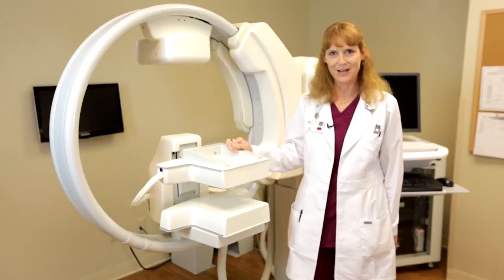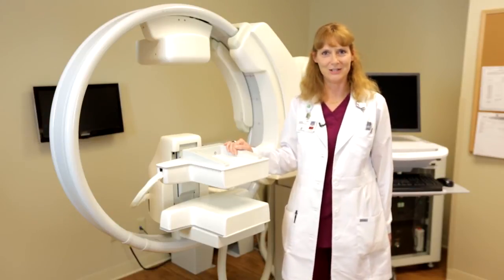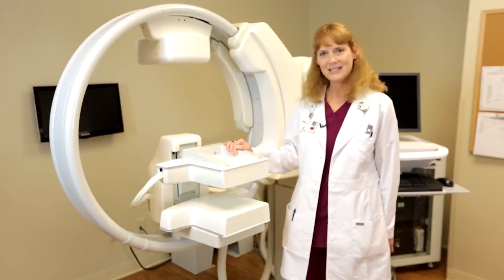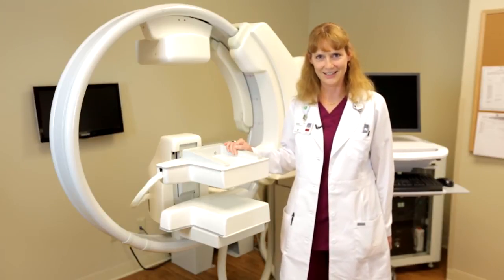Hi, my name is Dawn. I'm a nuclear medicine technologist at ProMedica Toledo Hospital Breast Care Center in Toledo, Ohio. We've had the LumaGym system now for two and a half years and currently to date we've scanned 2,091 patients. I would like to demonstrate the machine to you and show you how a molecular breast imaging scan is done.